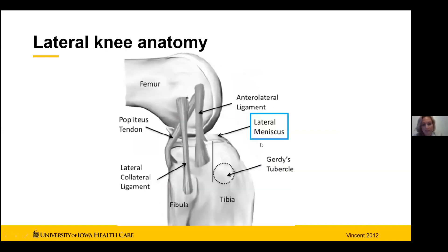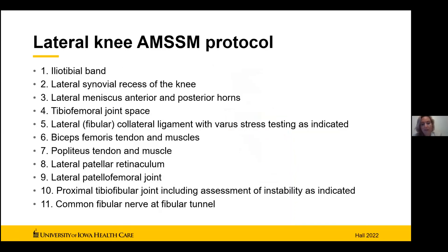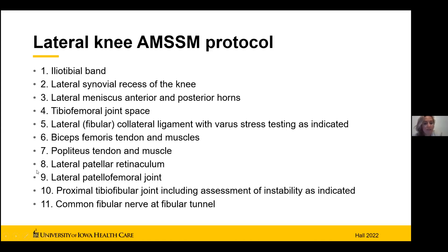We'll also look at the lateral meniscus, the popliteus, and then go through the AMSSM lateral knee protocol. This is pulled from Hall's paper published digitally last year. The protocol includes: the IT band, the lateral knee recess, the meniscus as visualized with ultrasound, the tibiofemoral joint space, the main knee joint, the LCL or FCL with dynamic testing, the biceps femoris tendon, the popliteus, the lateral patellofemoral joint, the proximal tibiofibular joint with stability testing, and the common fibular nerve.